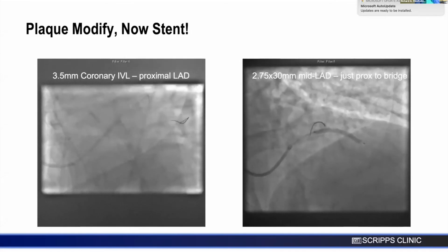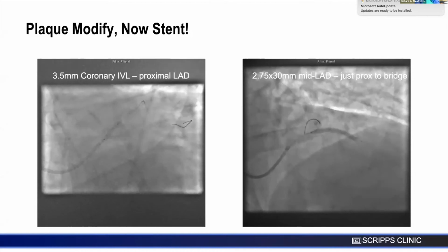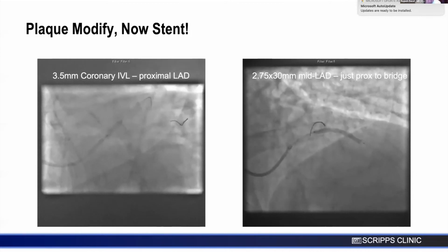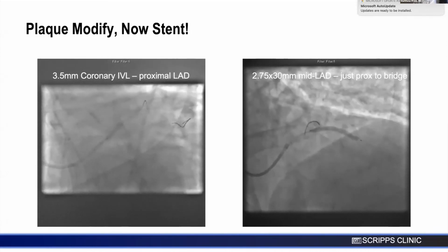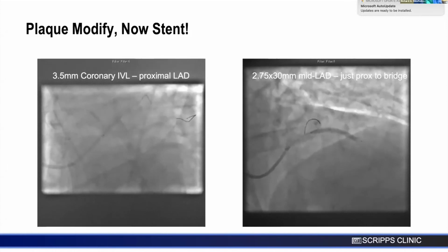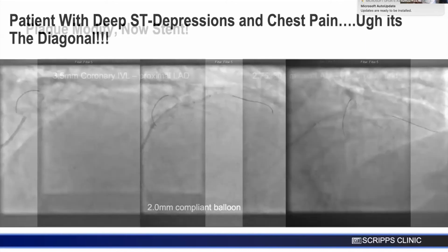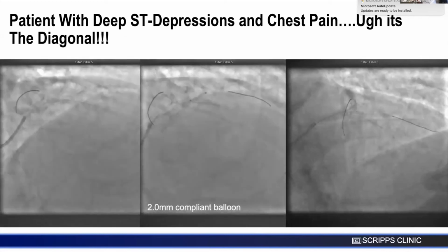So when you stent, you just stent right across that tight lesion and you size it to what? Because you don't really know the true size of the vessel. Right. I conservatively and carefully. It's tough. Is that a vague enough answer for you? Oh, that's probably why I took a 2.75 rather than a 3.0 here. And I post-dilated out there with the 3.0. All right. I'm all happy as clams.